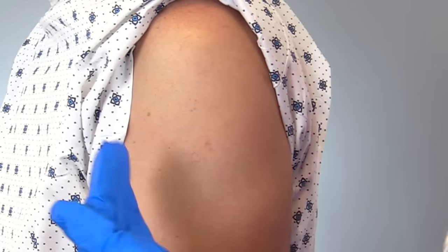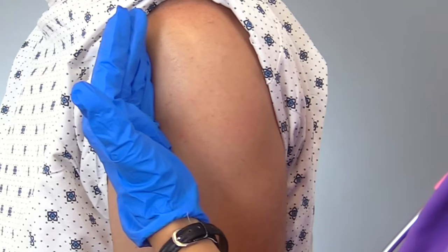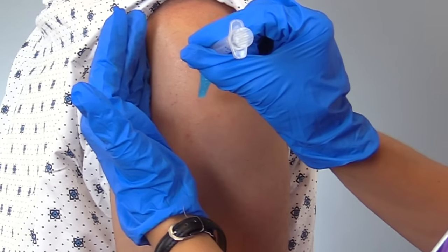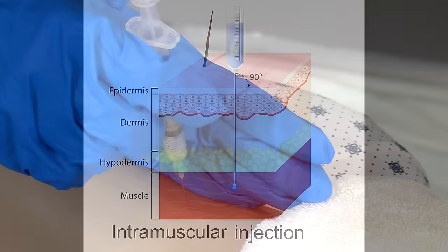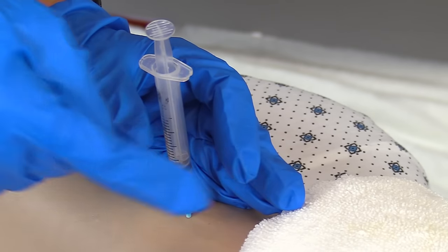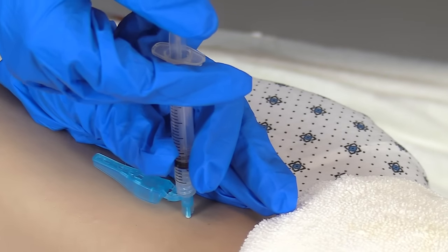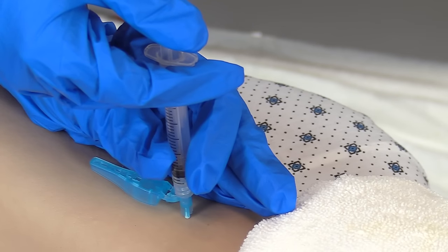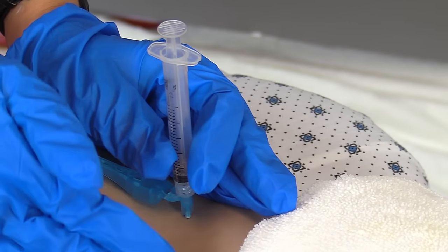To perform the Z-Track technique, take your non-dominant hand, go to the side of the injection site, put a little bit of pressure, and pull the skin to the side. Then take your dominant hand with the needle and go in like you're shooting a dart at a 90 degree angle. Do this quickly to cause the patient less pain. Steady the syringe with your thumb and forefinger, then use your dominant hand to depress the plunger and instill the fluid slowly — about 10 seconds per ml. For half a ml, that's about five seconds. Once instilled, wait about 10 more seconds to let all that fluid go down into the muscle.